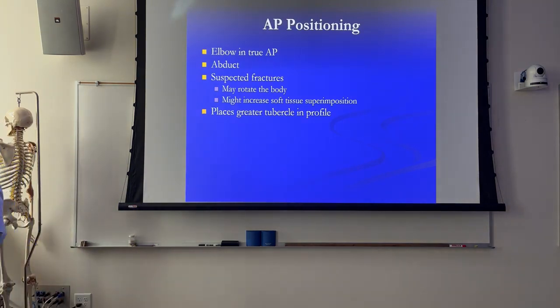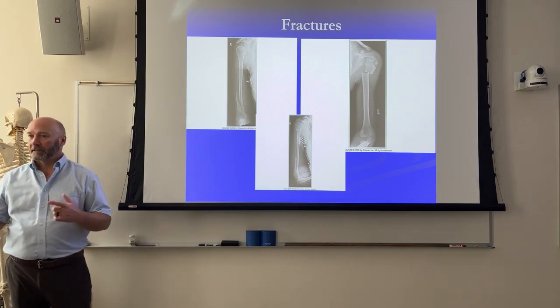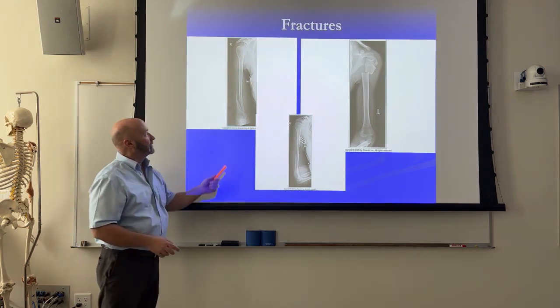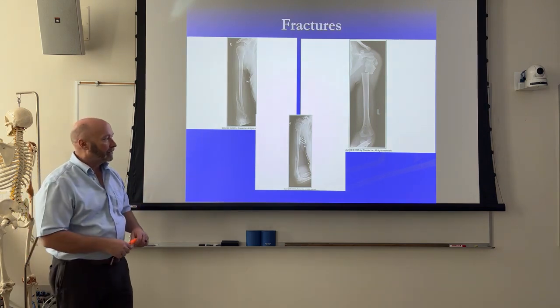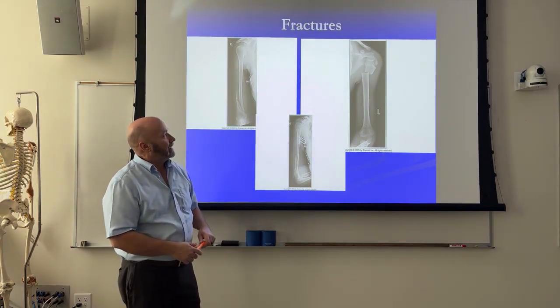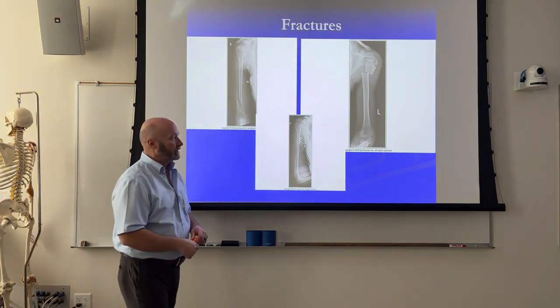Fracture types we see could be almost anywhere - distal fractures, proximal fractures. Depending on the patient's condition and age, the type of fracture determines the treatment. This is your characteristic spiral fracture, bayonet fracture - you get sharp shards. You can do damage to the patient by manipulating that, so you don't want to rotate that around. This one's in a sling - just a transverse fracture. Probably not a whole lot of damage if you rotate that, but it could potentially be a lot of pain. Another one we'll look at is an impacted fracture that usually happens in patients with osteoporosis. They fall and the shaft of the humerus goes up into the head - an impacted fracture.